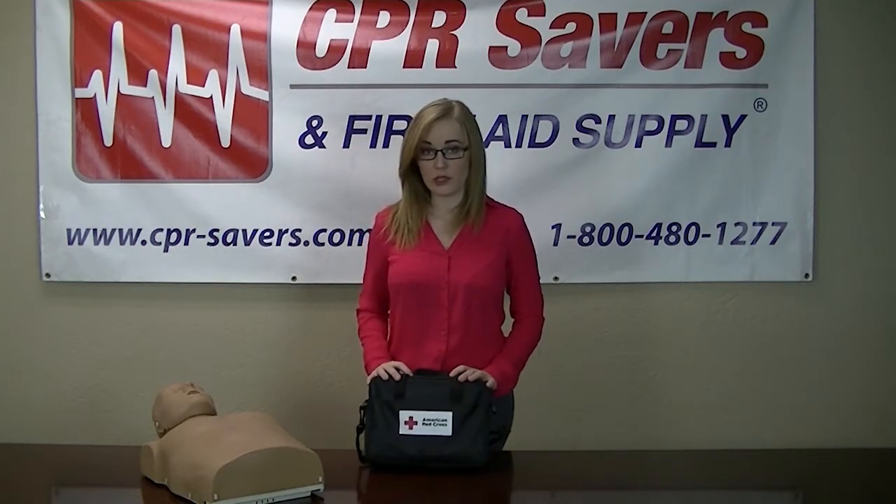Hi, my name is Layne. I'm here with CPR Savers and First Aid Supply to show you a little bit on the American Red Cross trainer.